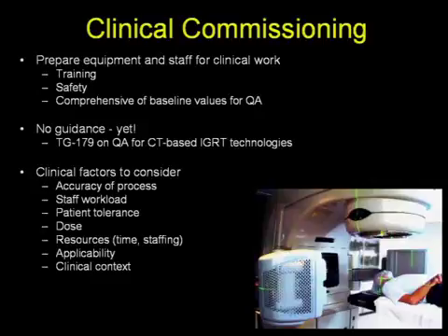Another factor that people consider is dose, so it would be well advised to have at least a record of what the dose is delivered for the intended imaging techniques for those that use photons. One must also look at resources, the time on the machine, and what staff is appropriate for these tasks. For instance, clinics that involve ultrasound typically try to recruit someone who has some ultrasound experience in order to expedite the learning process and also the reliability of the results.